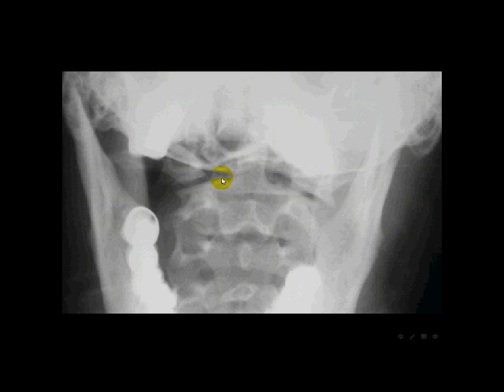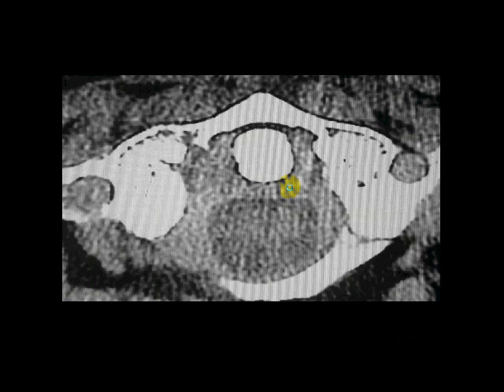This indicates disruption. Looking carefully at the articular process of C1, we see that it is not overlapping very closely with C2 and there is a displacement issue from both the right and left sides. For this, a CT scan was ordered, which clearly showed that C1 has disruptions or fractures at several sites, including the left posterior arch, the left anterior arch, and the right posterior arch.